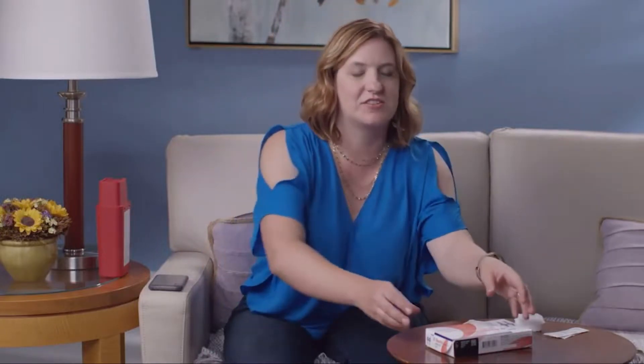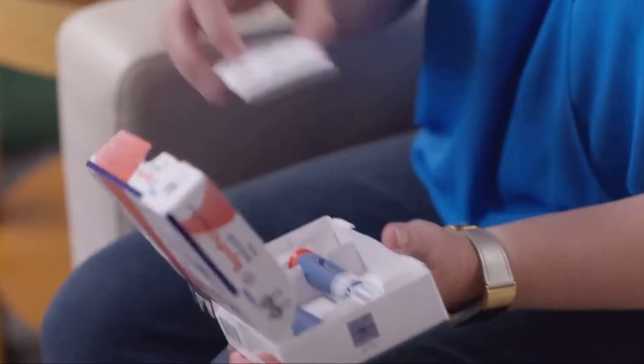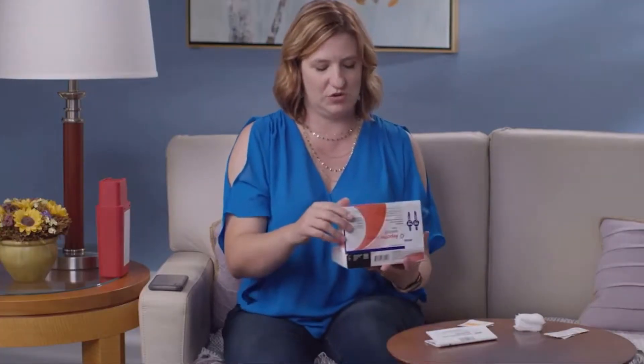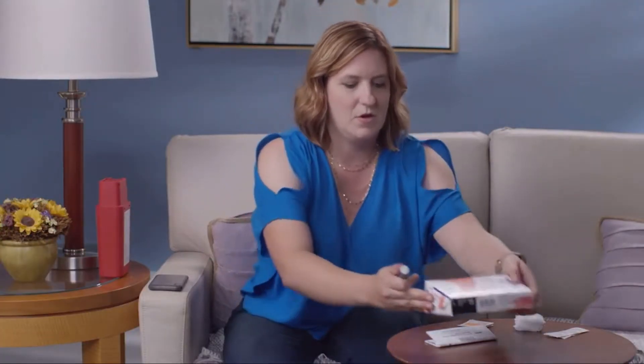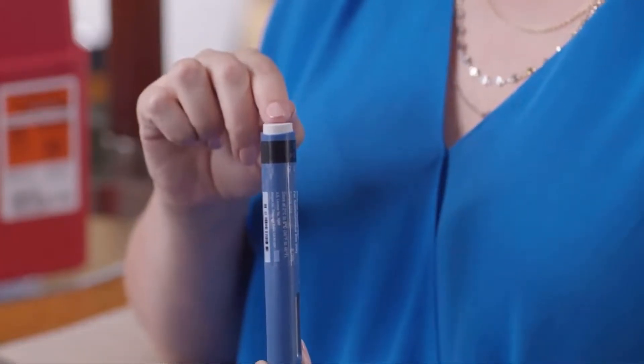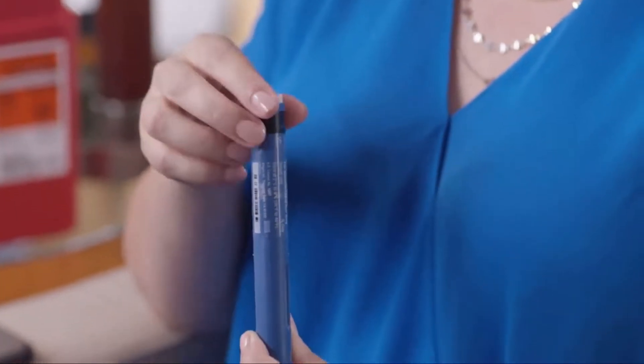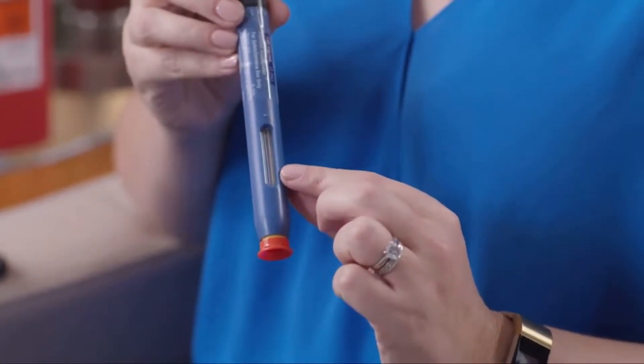Now let me show you the auto-injector. When you open the carton, you'll find that there are instructions for use right inside. Once you remove the injector from the carton, take a look at it. This is the gray start button. This is the expiration date. This is the window where you can see the medicine. This is the bottom with the orange cap covering the yellow needle guard. Make sure that the cap is secure.